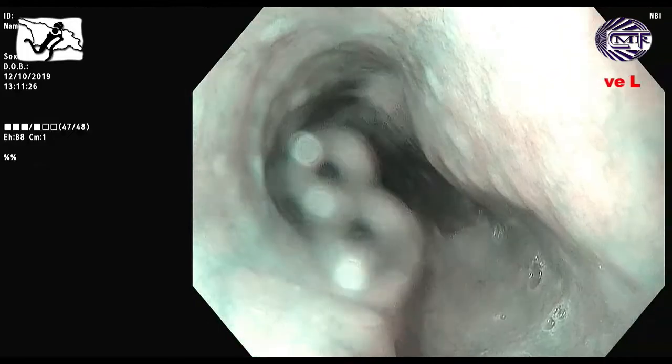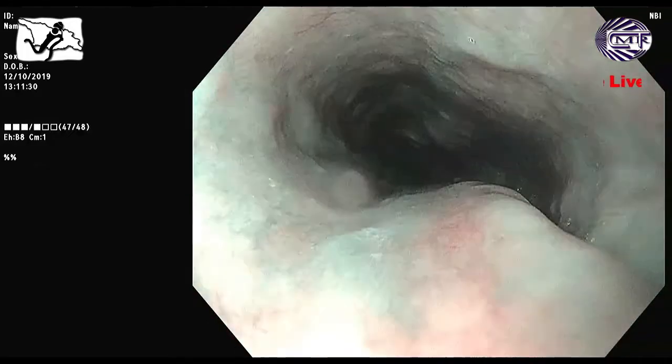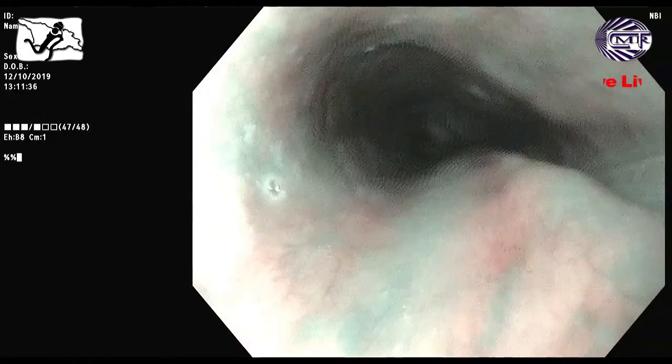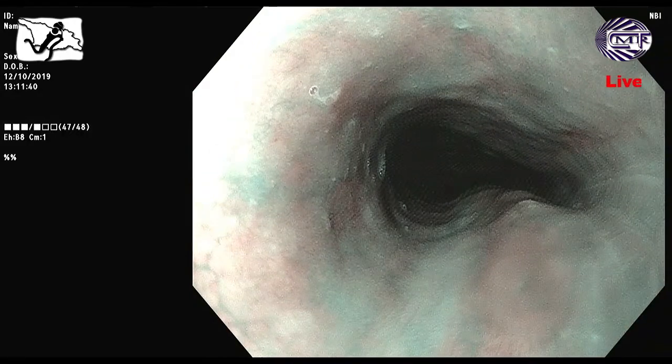Okay, this patient's esophagus is relatively safe. I remember 2 years ago, my demonstration case was esophageal cancer. Squamous carcinoma. Yeah. Upper part, right? This is okay. Do you want to need an H. pylori test for the patient? No?